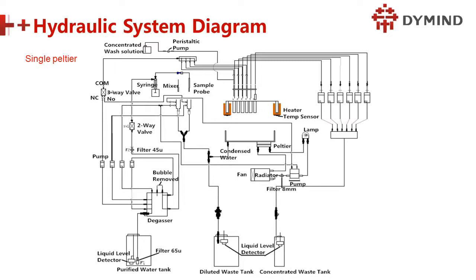And so here comes the question: why do we use the peristaltic pump? Why not use a liquid pump? Do you know the reason? Okay. Any other reason? If we are saying we need a small amount of the liquid, right? So why don't I use the syringe or maybe a small pump?